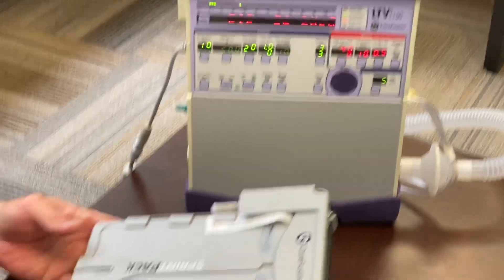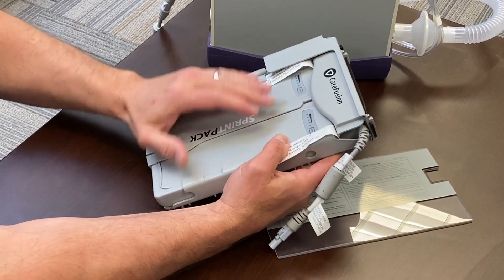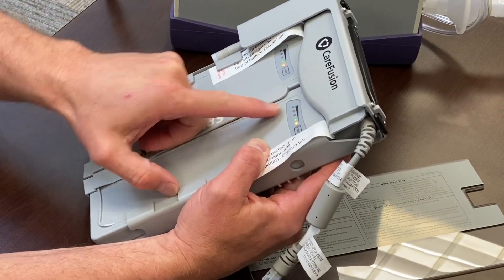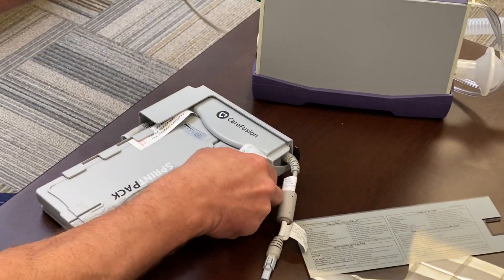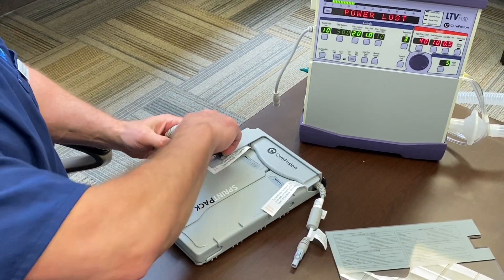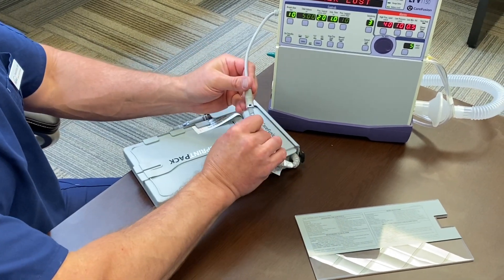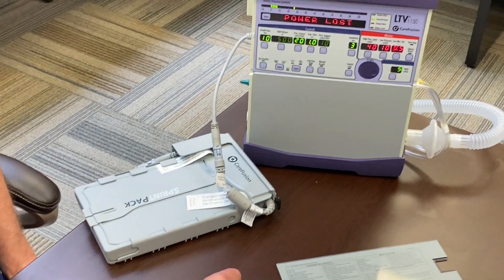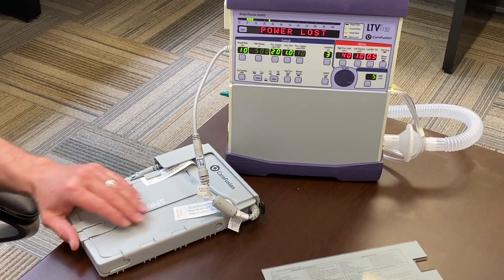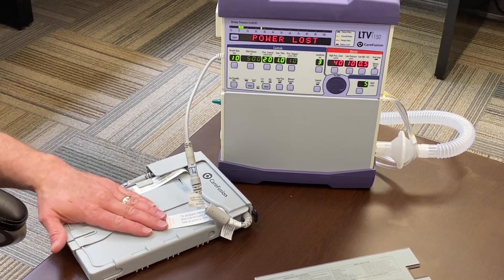This is the new external battery. We're not going to activate it right now because it's brand new, but pulling the tabs will activate the battery. This test will show you the power level of each battery. To utilize and charge it, press the button, remove the cord, plug the battery in right here — essentially creating a loop cycle: still getting power from the wall while charging the battery. At any point when you need to go mobile, just unplug the external source from the wall and the battery will kick in.